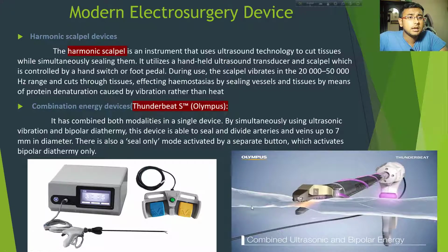As we know, previously normal bipolar procedures were used only for vessel sealing or vessel coagulation, but these machines can do cutting and coagulation at the same time.